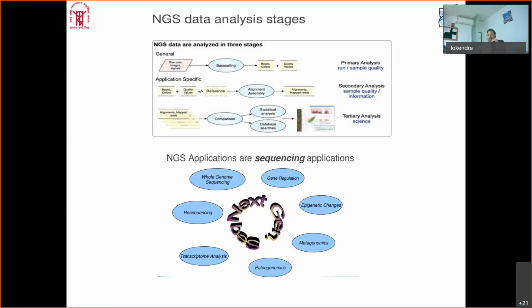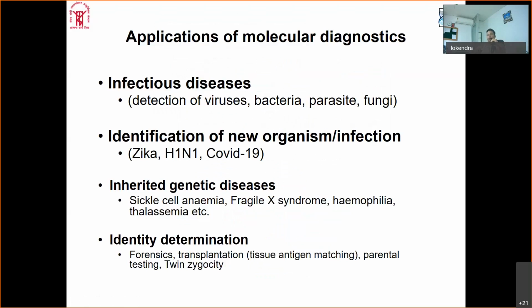Okay, so NGS. If we have to look at the overall molecular diagnostics, molecular diagnostics can be an important tool to identify infectious diseases, and COVID is one of the best examples nowadays, and it is very relevant. You can clearly identify it with the use of the various techniques that I mentioned. I think most of the research community nowadays is using these methods to learn more about the COVID-19 virus infection and associated problems.